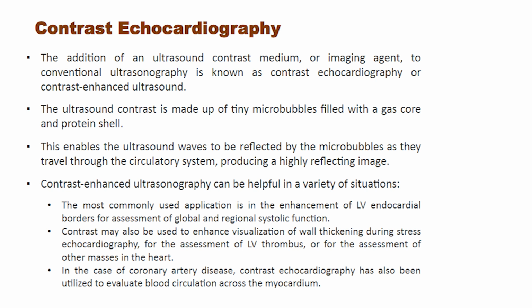The ultrasound contrast is made up of tiny microbubbles filled with a gas core and protein shell. This enables the ultrasound waves to be reflected by the microbubbles as they travel through the circulatory system, producing a highly reflecting image.